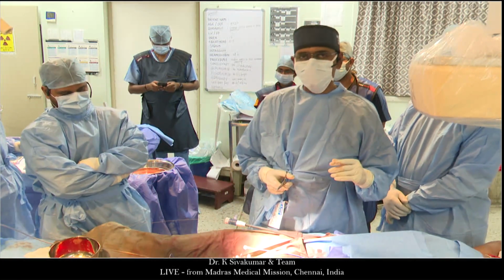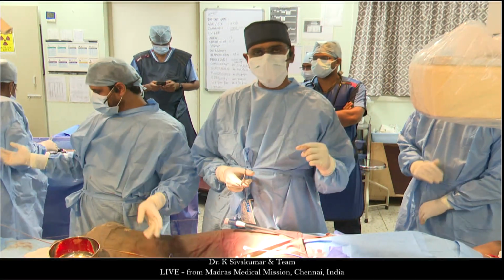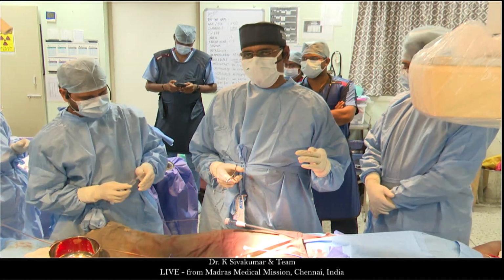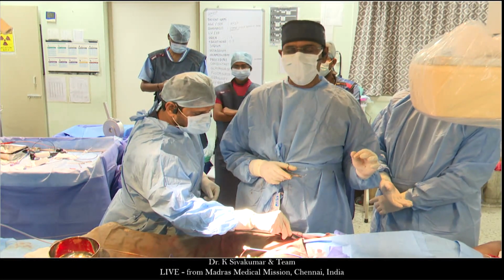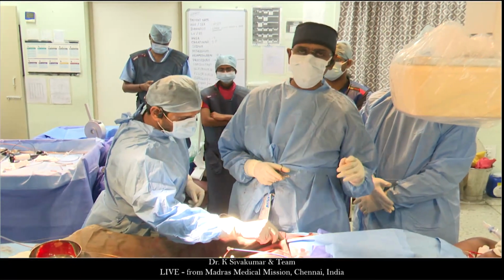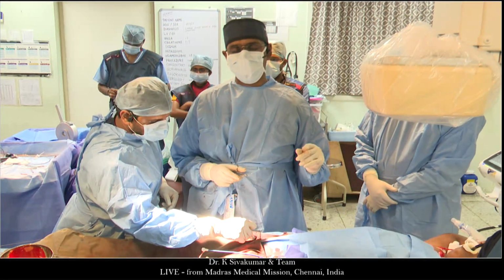So our strategy is superior vena cava plus 4. If there is a pulmonary vein obstruction, minus 2. If there is a residual flow, plus 2. Having done a few, we have always observed that whenever we use plus 4, invariably the first balloon will produce a complete occlusion. We don't use a compliant Amplatzer sizing balloon. We always use a semi-compliant ZMED balloon or a BIP balloon.